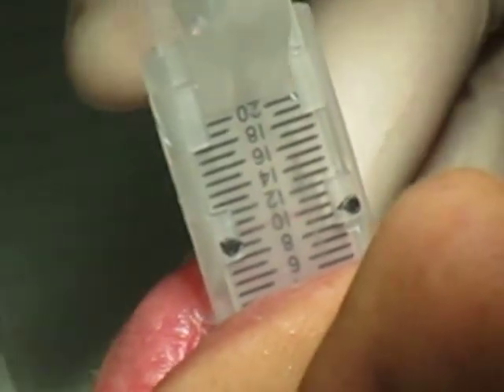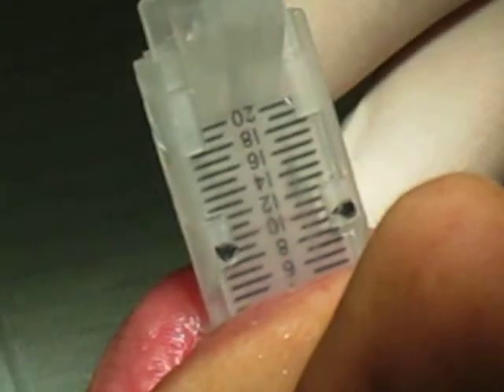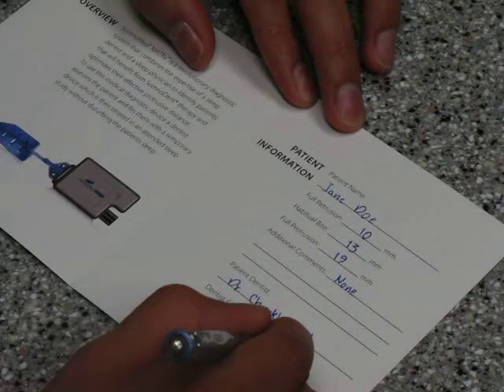These scale readings should be repeated 3 times to confirm accuracy. Once you have verified the accuracy of the patient's scale readings, record these measurements in the patient's prescription card. These readings will be needed by the sleep lab on the night of the patient's titration study.